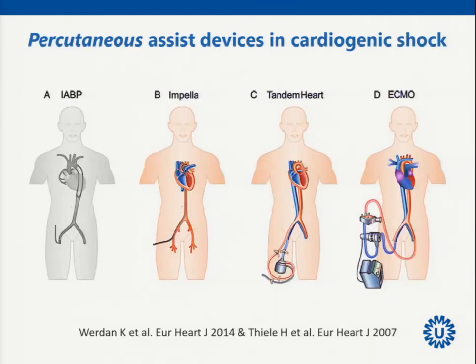And then you have the Impella device, the Impella 2.5, which is not such a successful device, as you might know from the literature. The TandemHeart is not used very frequently anymore. It's also a complicated device where you cannulate the left atrium via the interatrial septum, and you pump the blood back retrogradely. It's very crucial that the position of the cannula is perfect, and there have also been reports of some leg ischemia, so that is also out.